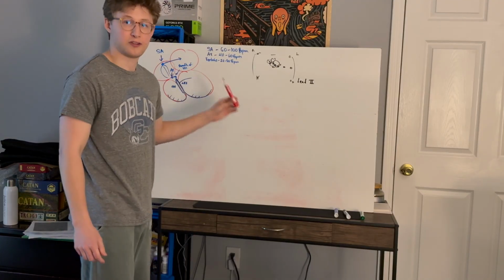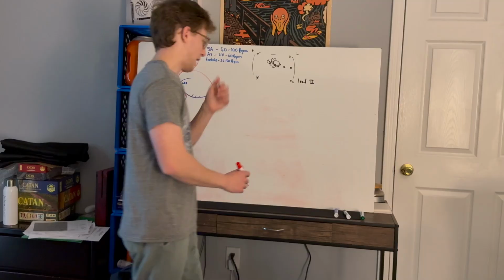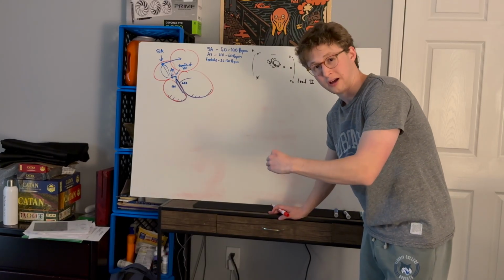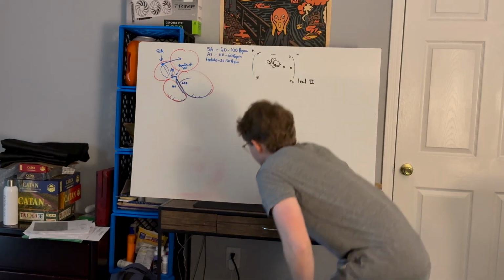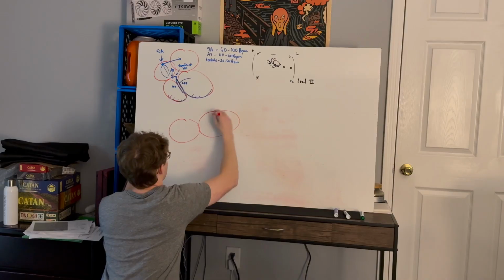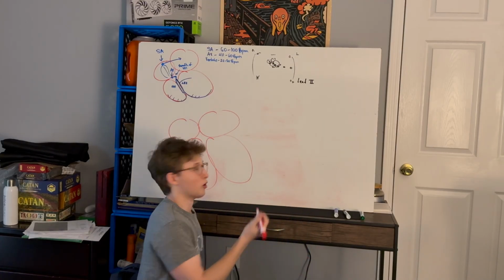And let's talk about how we systematically look at an ECG, what the different waves mean, and how that corresponds to what's going on in the heart, so then we can start to understand what abnormal heart activity looks like. And then we can understand, based on what we're seeing, what's going on in the heart. So let's draw another heart right here. And then we'll do normal sinus rhythm.